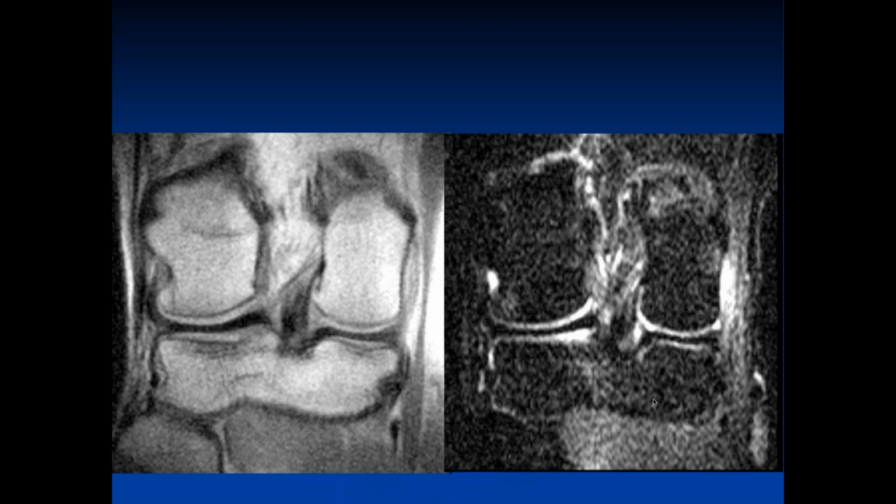Okay, so this is a lower field scanner, and let me just, can't find my cursor here. What am I going to do with it? Wrong screen. There we go.